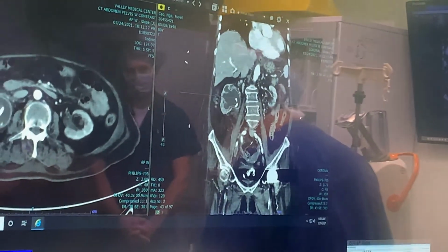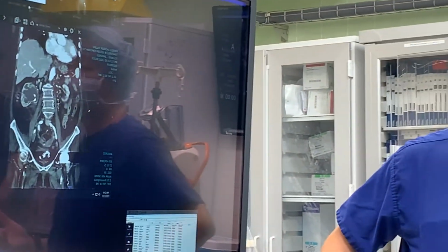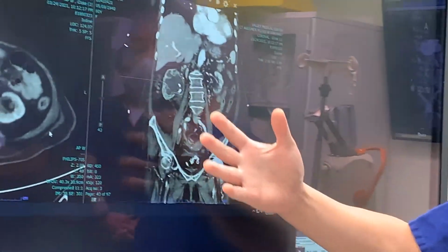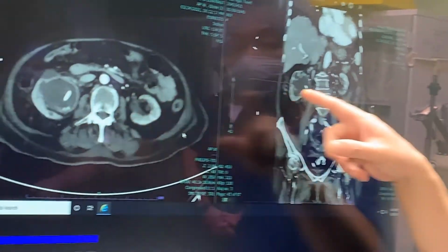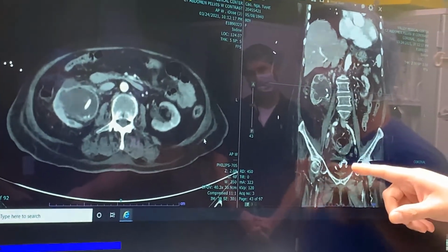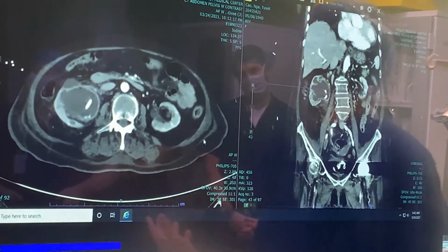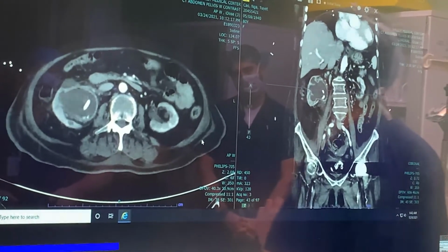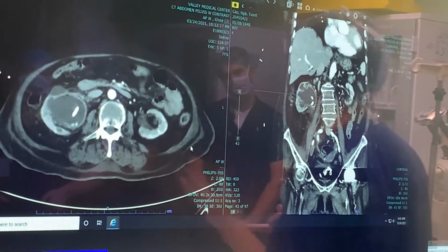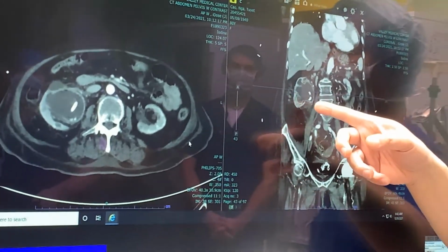All right. So obviously the kidneys are in the back, and this is a patient that we did a perc neph for back in March of this year. This person already has a ureteral stent, which is going all the way down into their bladder, but the stent oftentimes gets obstructed. Ureteral stents that urology places are oftentimes only 6 French or so, 6 to 8 French, and they just tend to get occluded very quickly. And so it's not uncommon for us to have to put perc nephs in those situations.